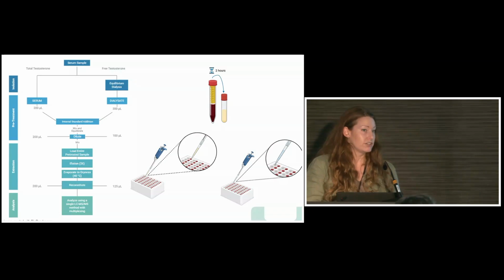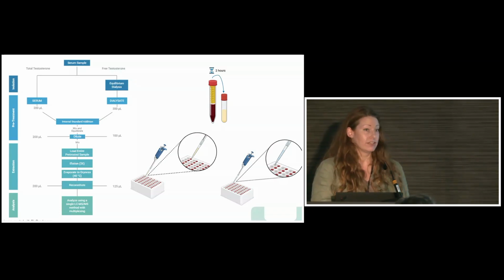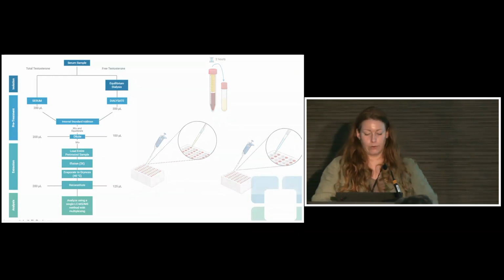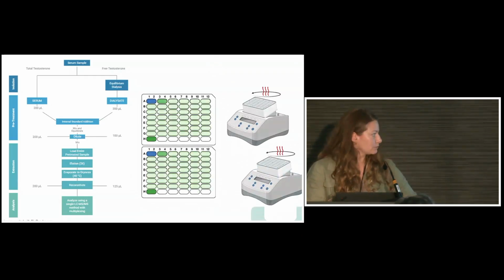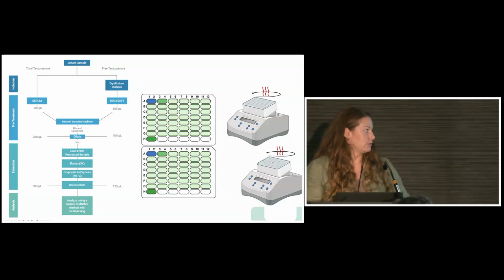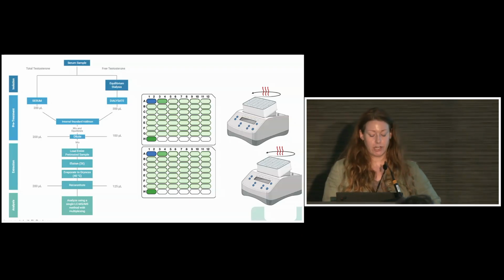That's another consideration for the lab. It's very obvious that that's a serum chamber. And then your buffer is added to this white buffer chamber. They will go through dialysis for 8 hours at 37 degrees C. That's just your body temp. And we do like gentle orbital shaking.